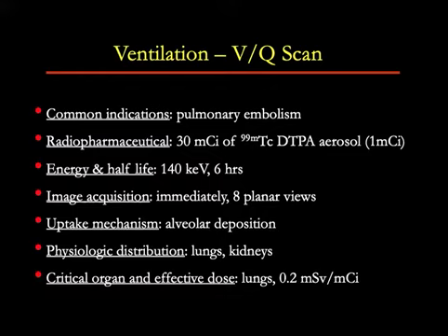The common indication for doing a VQ scan is to evaluate patients for acute or chronic pulmonary embolism. With the advent of CTPE protocol, the study of choice for ruling out or ruling in pulmonary embolism is CTPE protocol, and for some reason if CT cannot be performed, that's when the patients get a VQ scan.